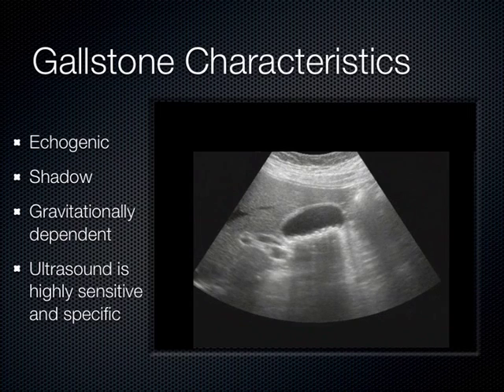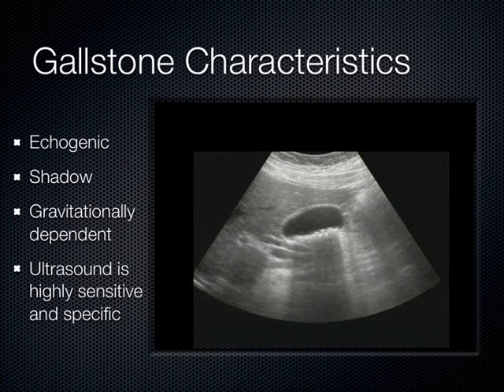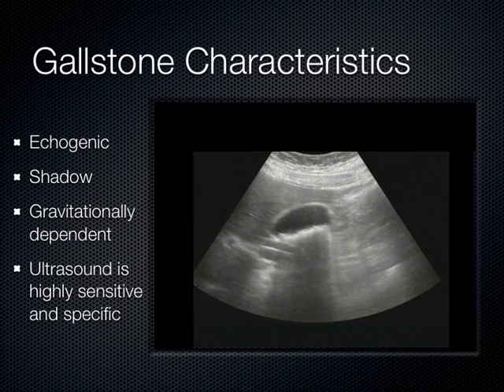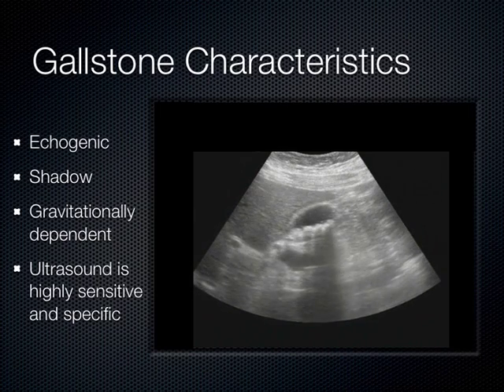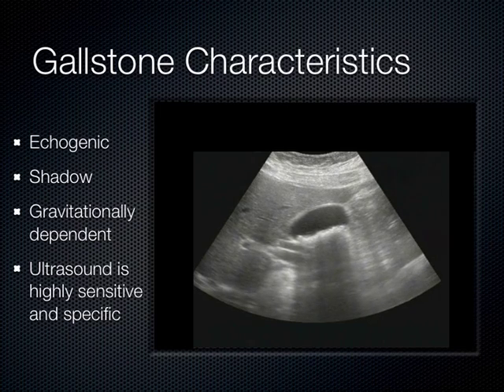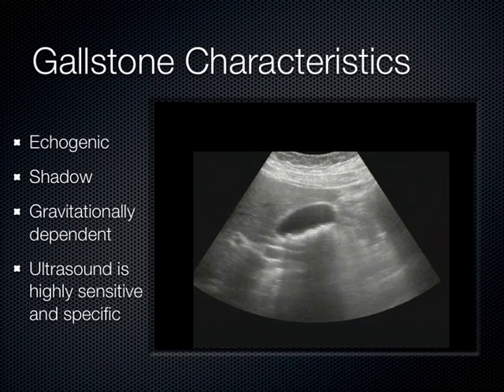But when you find the gallstones, they're really fun to look at because they're echogenic, they shadow, and they're gravitationally dependent. So as you move the patient around, the gallstones will move around on you. And for these reasons, ultrasound is the test of choice. It's the most sensitive and specific imaging modality.